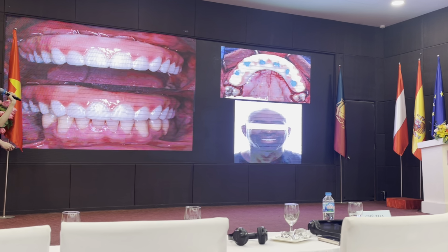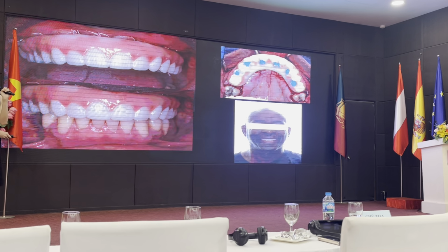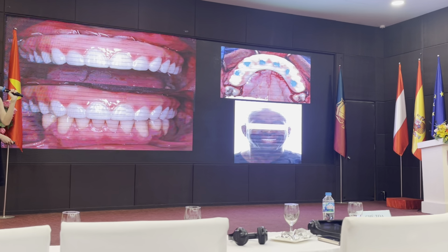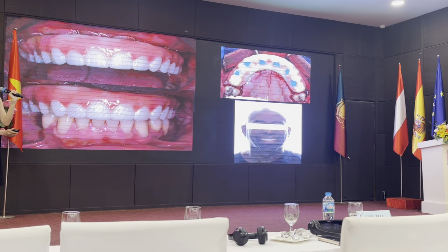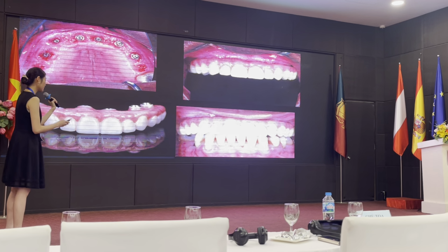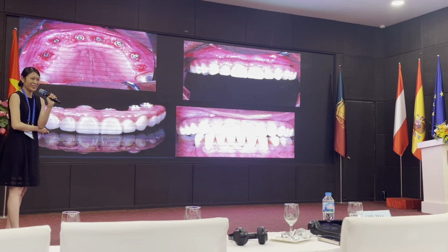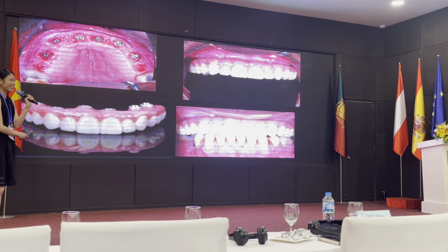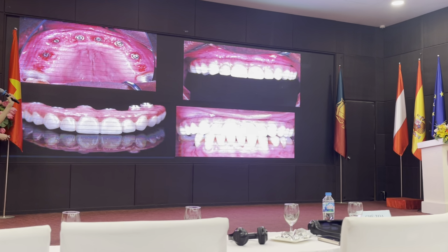And then we confirm with patient's smile, because this is a big surgery, so after the surgery, what we should do is we should take a panoramic film and also the post-surgical CBCT if there is something you feel that might go wrong. And then also, I graduated again, so this was the transfer case. And this was the final photo that I got from my co-resident.